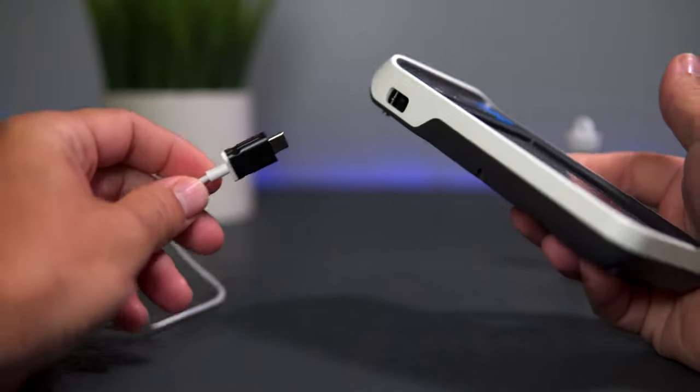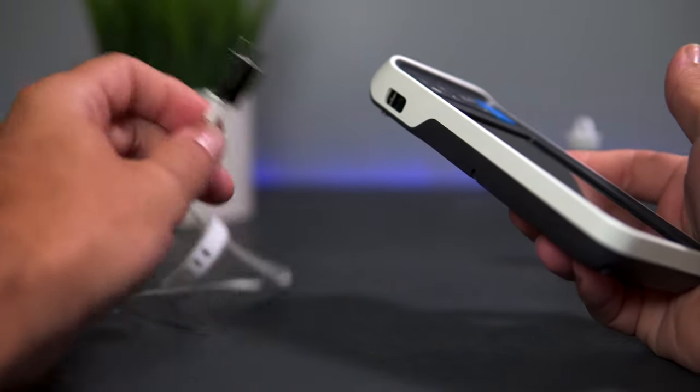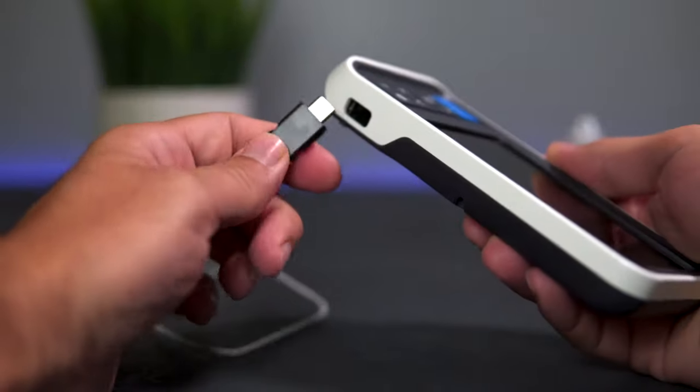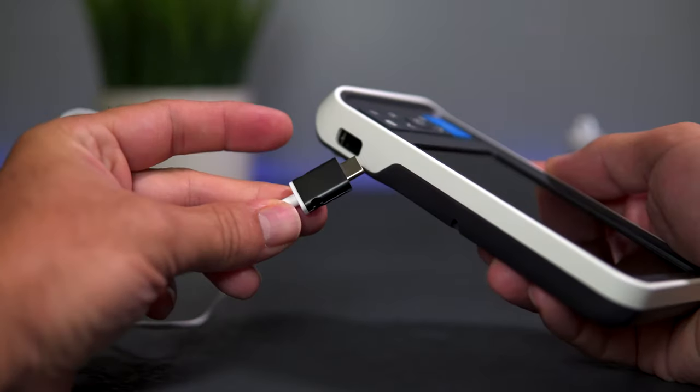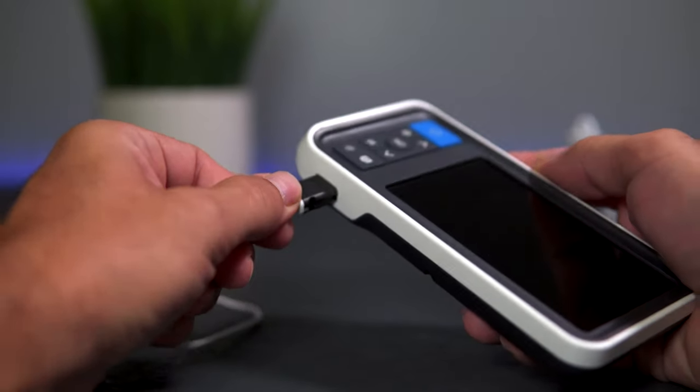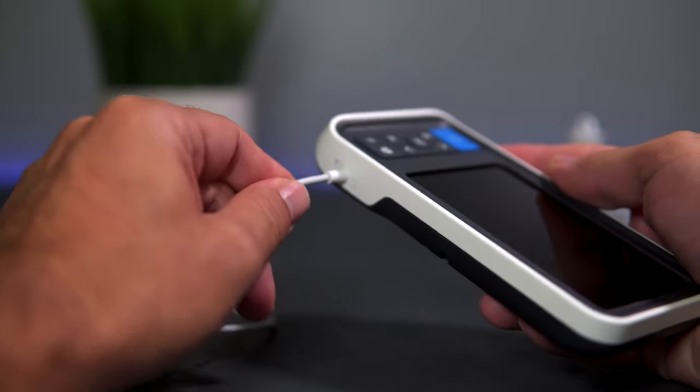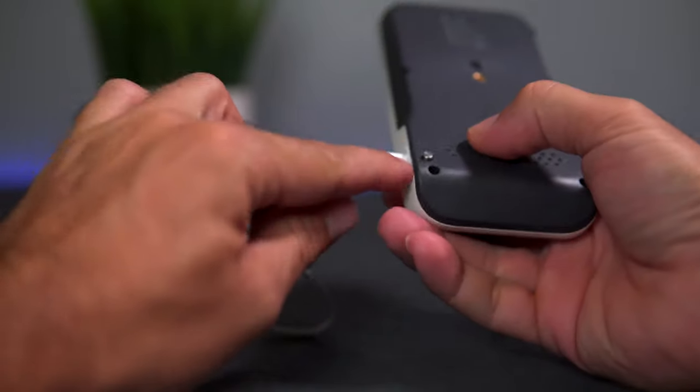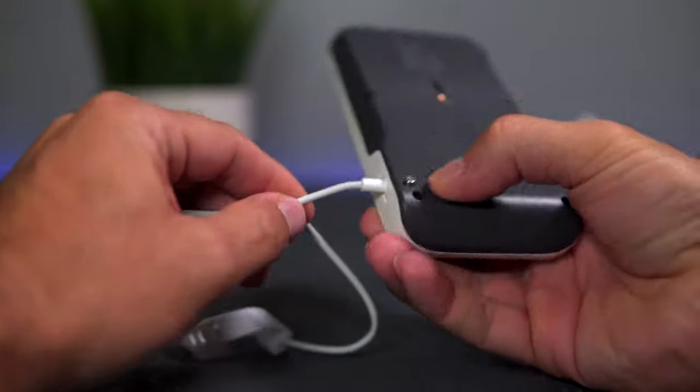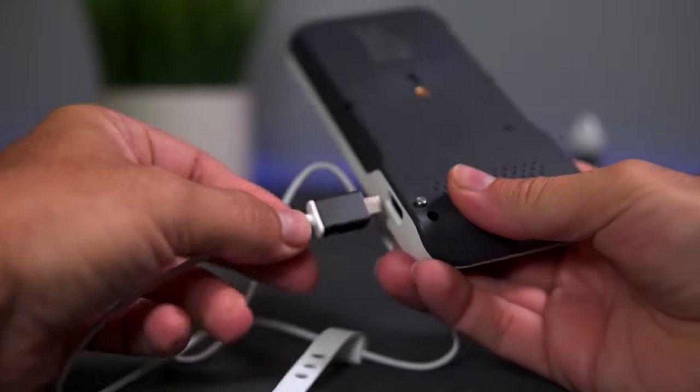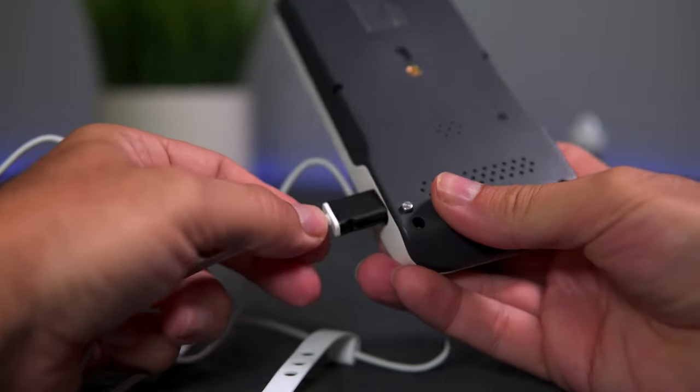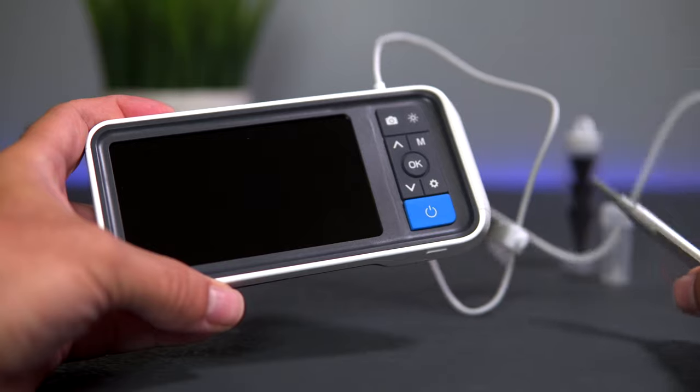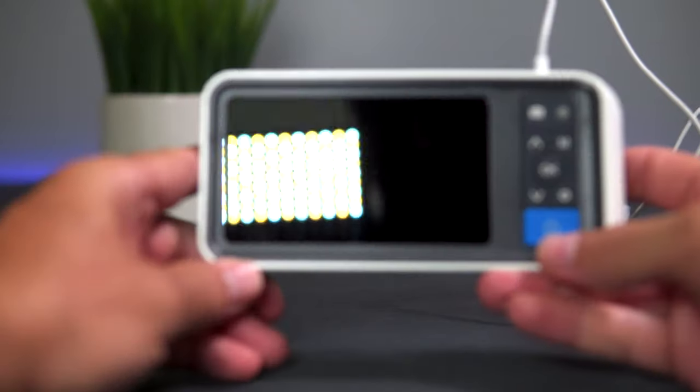Let's start by connecting our probe to the control unit. It doesn't matter which way it goes since it's USB-C, and it actually clicks in there and locks in. To release it, that's what this button's for. Now that the probe is in, let's power this thing on and see what it looks like.